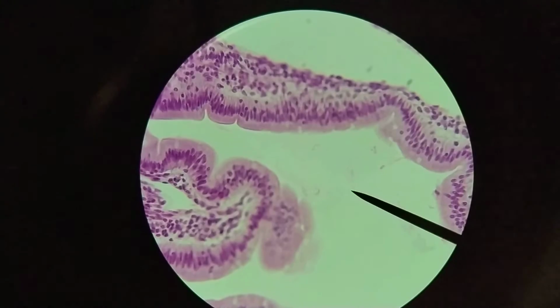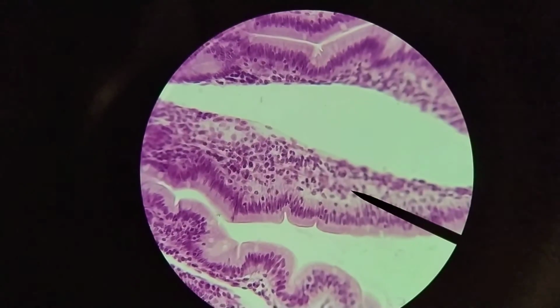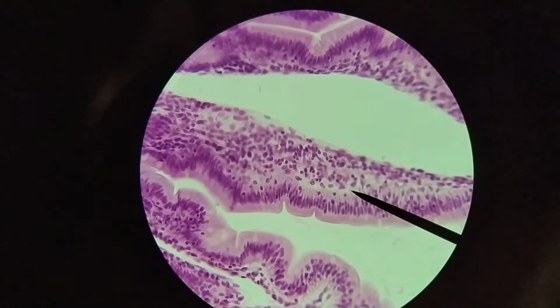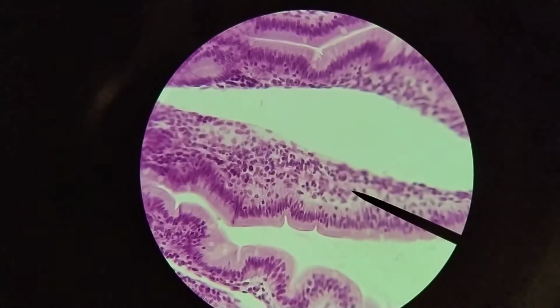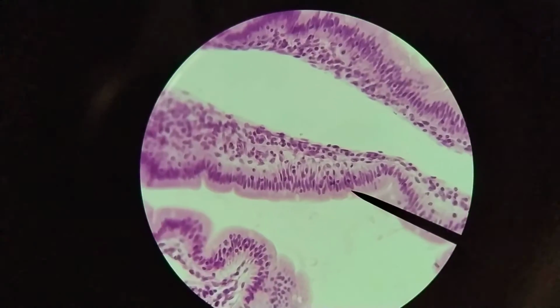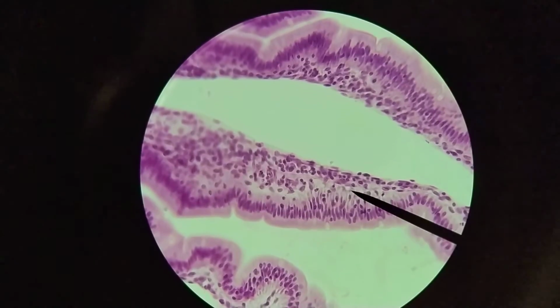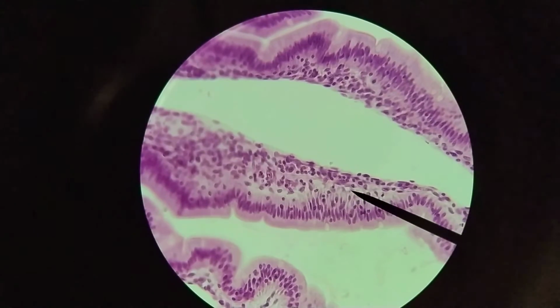Those will be collected by the capillaries. And so the capillaries are just underneath the epithelium here. We're going to have some capillaries down here. Okay, so for example, here, I think this region right there might contain a capillary. I think there's another one that's kind of cross-section visible right here.